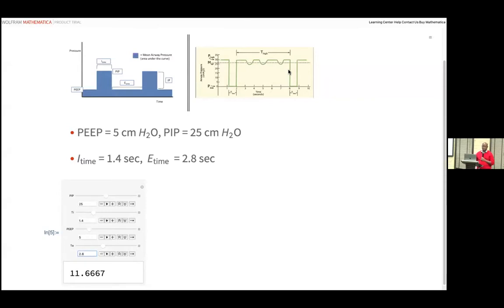This is a very stiff lung. Of course, when you're blowing into a balloon that is stiff, you need to spend a lot of time blowing it in. So now we change the inspiratory time. Like in APRV, we'd like to do the inverse. It's some sort of inverse ratio ventilation, where the inspiratory time is like 9 times the expiratory time. And it's a slower mode of ventilation.